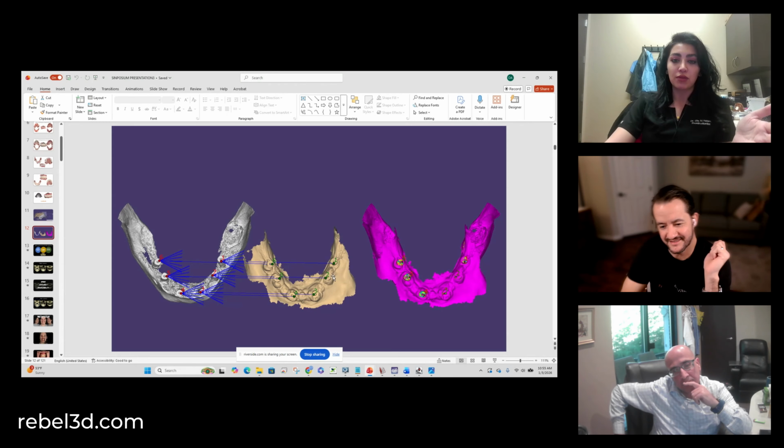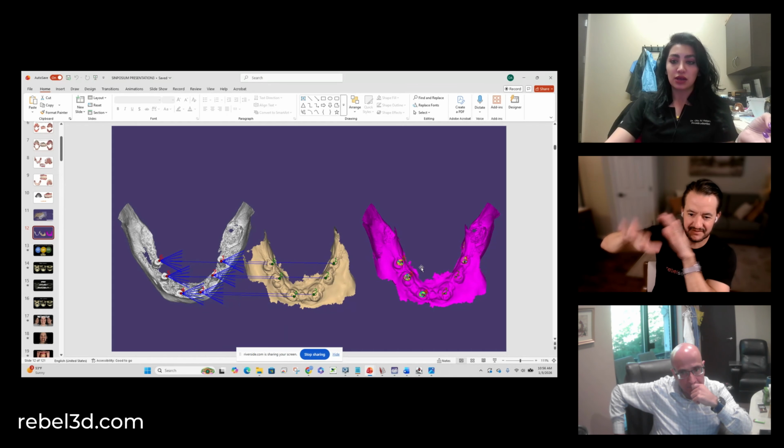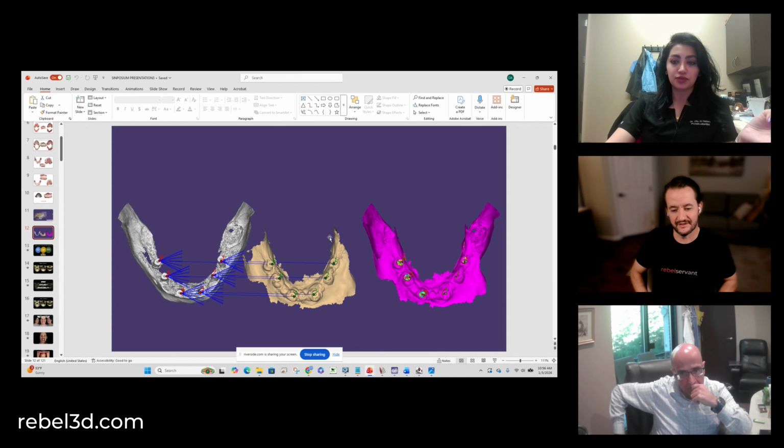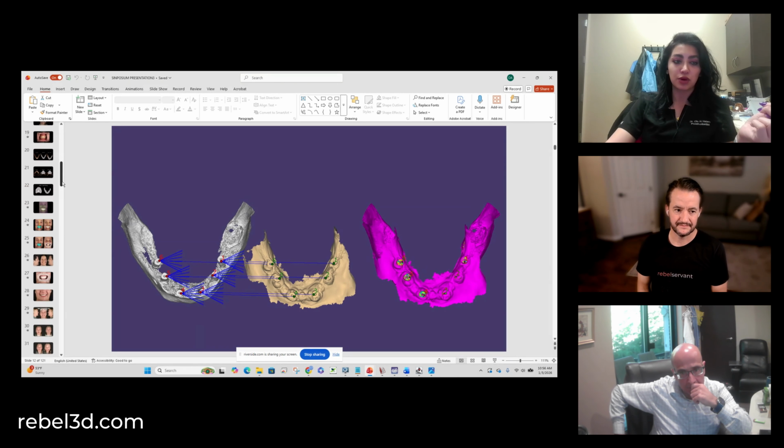So of course you don't want that. It's that cross arch accuracy, yes, of data stitching. You might lose some accuracy as you're moving around the arch. Yeah. So you don't want to rely on your intraoral scanner for the bite purposes.